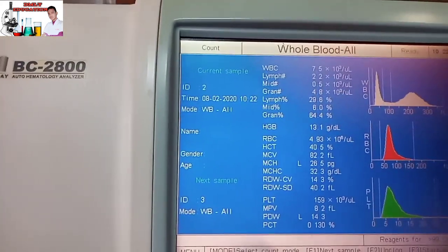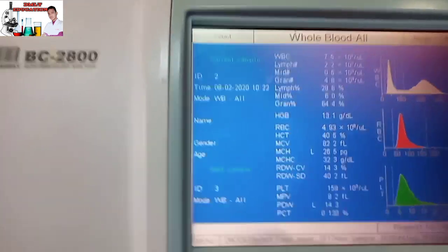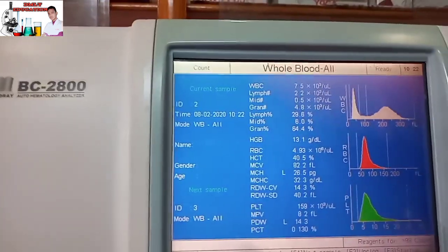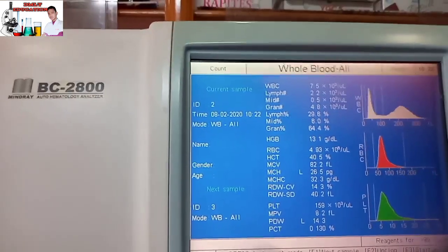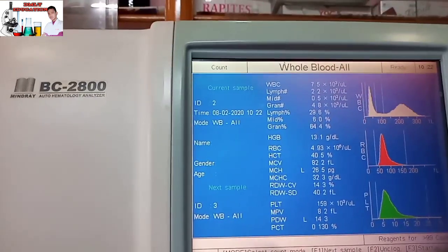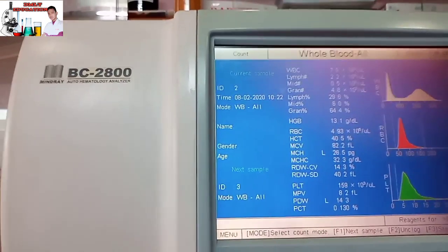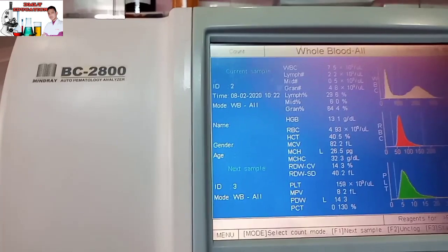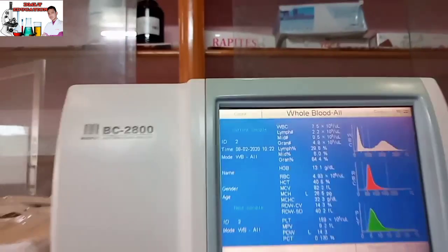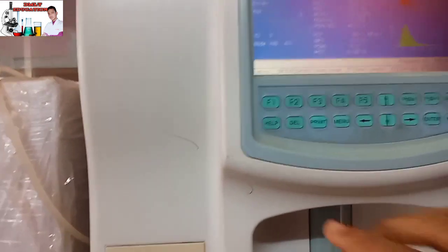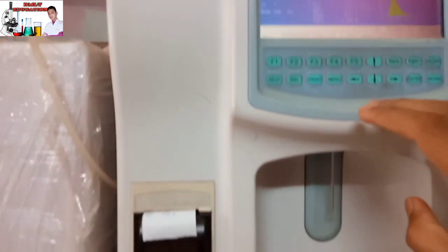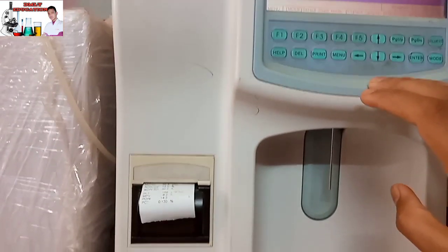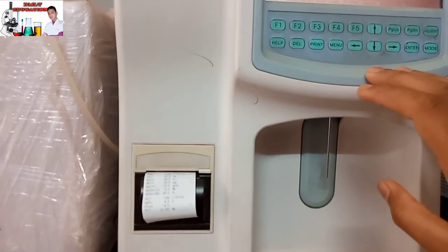WBC 7.5. Lymphocytes, Monocytes, Neutrophils. I will show you the results.